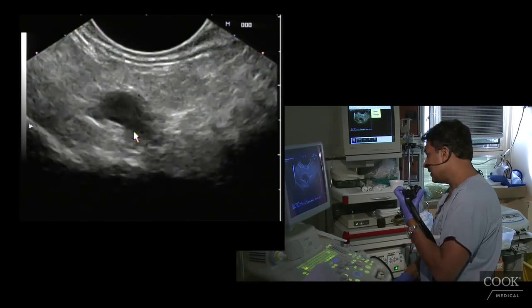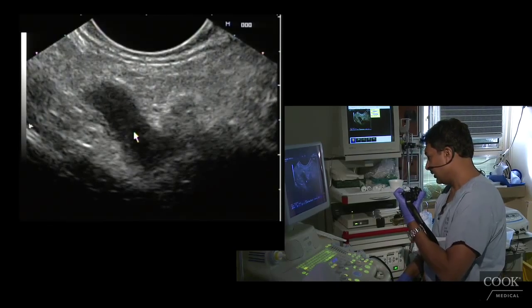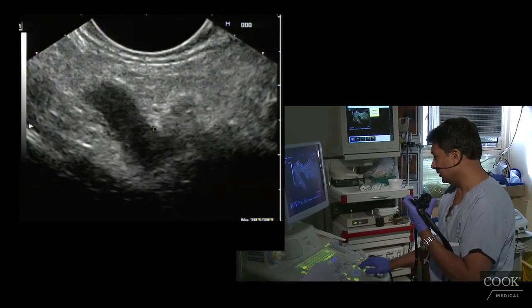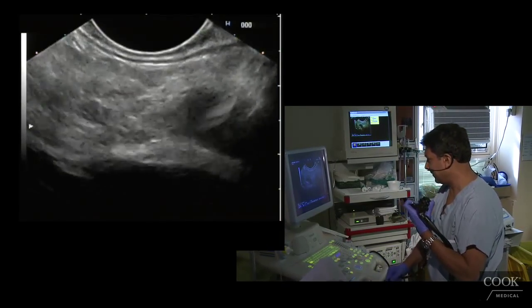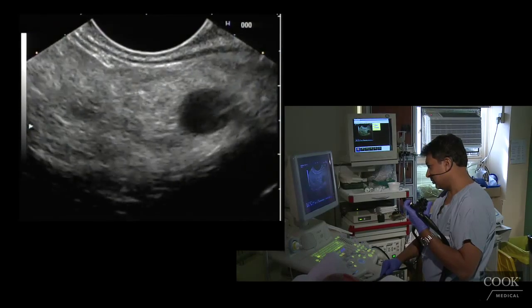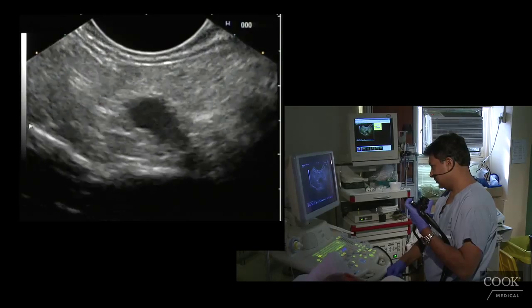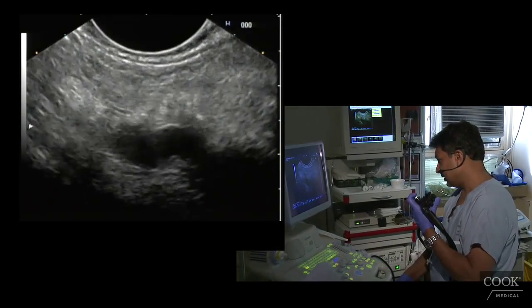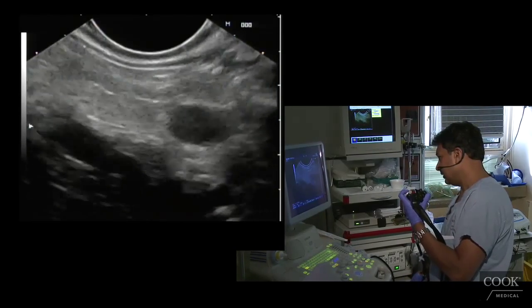And then that is a malignant looking obstruction of the pancreatic duct. Okay, that is a very, very abnormal duct. And you wonder if the walls are a little thickened. I think this guy, I don't know. I mean, I think they should probably consider just taking this out. I could biopsy the stricture. But that is a malignant looking obstruction.